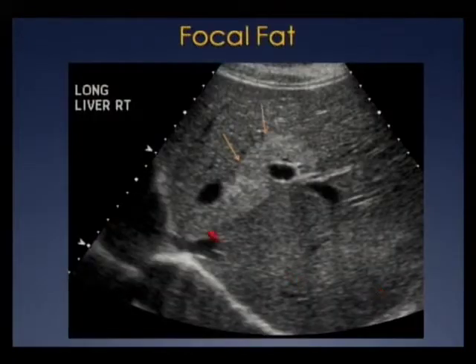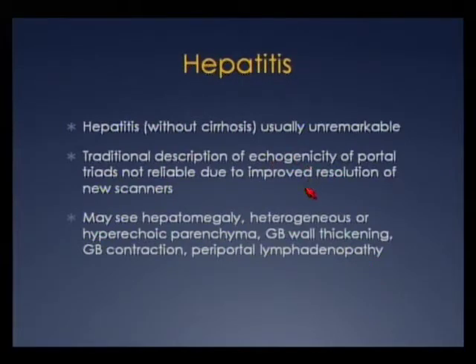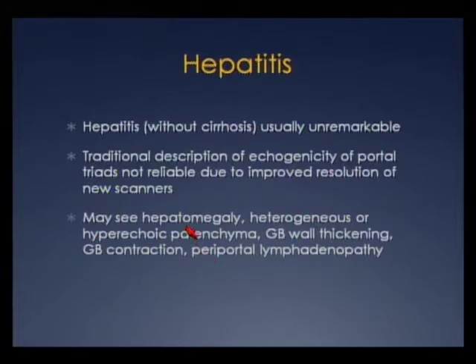Here's a nice example of focal fat where we see an echogenic focus draping around the vasculature of the liver without displacing the vessels. Hepatitis without cirrhosis is usually unremarkable by ultrasound. The traditional description of echogenic portal triads doesn't hold true anymore with modern machines. But you may see hepatomegaly, heterogeneous liver parenchyma, gallbladder wall thickening or contraction, and periportal adenopathy.